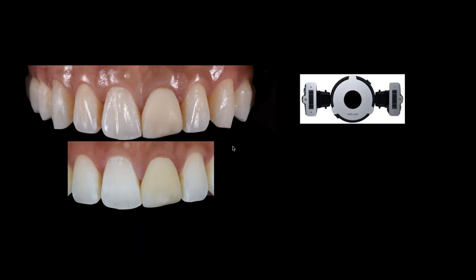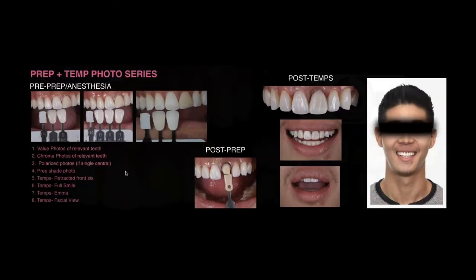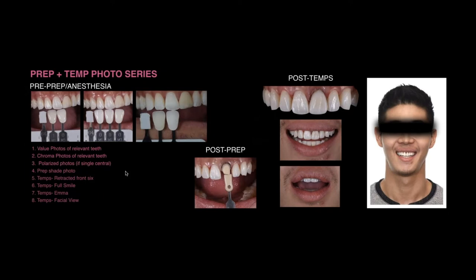I think as ceramists, we probably look at that tooth on the bottom and we think, wow, I can actually see a lot more of the depth and detail and opacity and translucency. And I can also tell where some of the banding is, more surface oriented. So all those things really give me some ability to figure out my positioning of my ceramic materials as I go through the process.